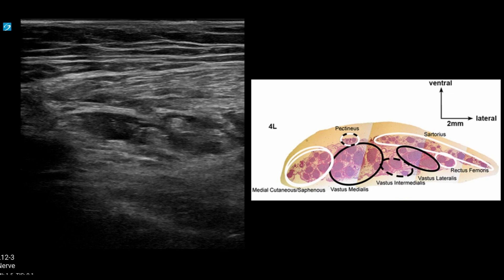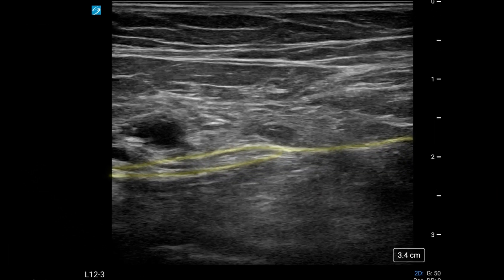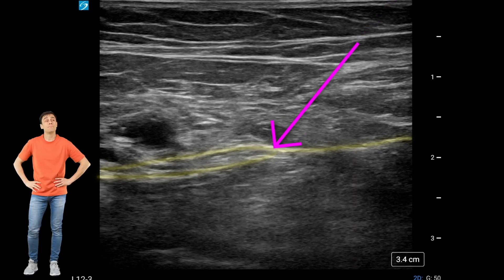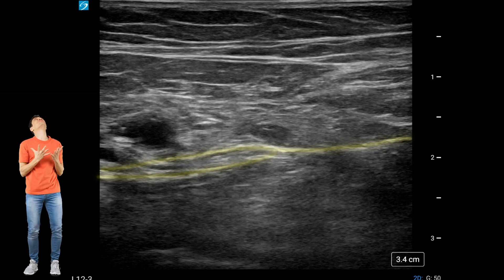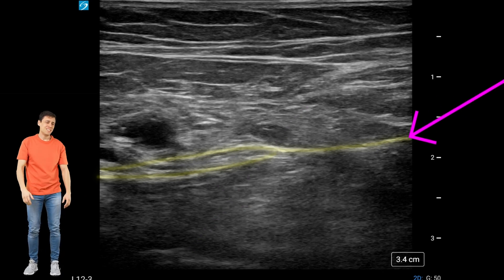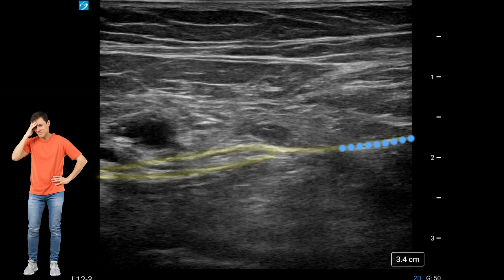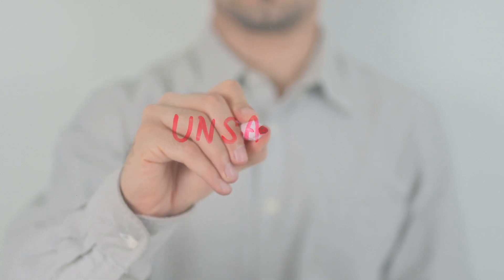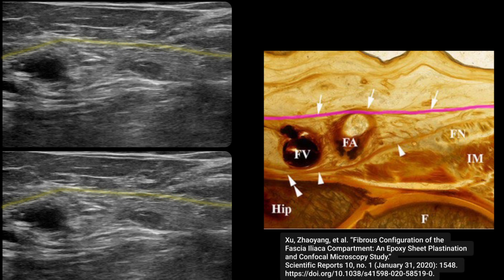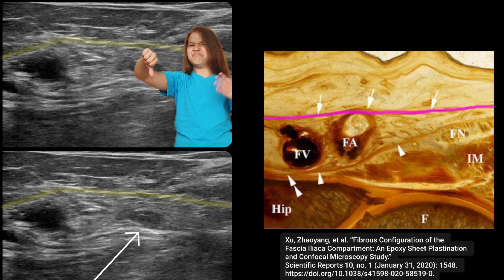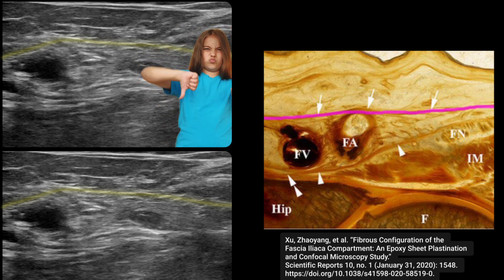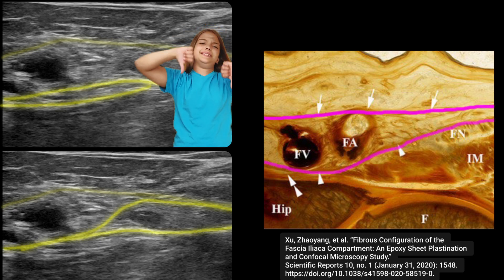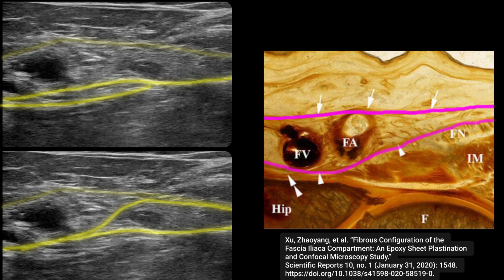Where this happens with respect to the inguinal ligament or the common femoral artery is quite variable. Reviewing the needle approach that we might have chosen, this trajectory was going straight towards a nerve. There was a combination of patient, anaesthetic, and systemic factors that led to standing next to the patient with a needle in hand, not absolutely confident that what we were about to do was safe. I intentionally misled you at the start of the video — I wanted to recreate the effect of the confirmation bias we were under. We were probably mistaken in thinking that this bright white line was the fascia iliaca. In reality it's probably just a really echogenic epimysium of the iliacus muscle, and that often creates the inferior border of the fascial plane that contains the nerve.